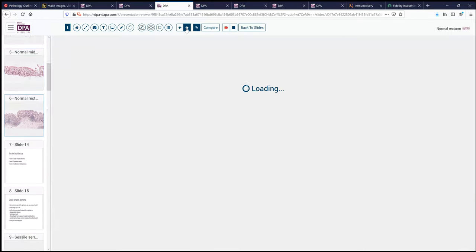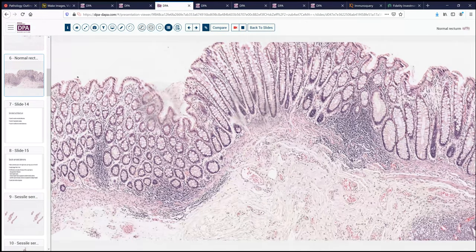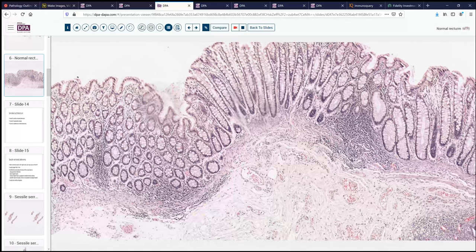Moving into the rectum, we will more frequently see some evidence of lymphoid aggregates. And occasionally we'll see some shortening of these glands — as you see here, there are a few that don't quite reach the muscularis mucosa. That's more frequent as we find more tissue in the rectum. These crypts are fairly closely spaced, and oftentimes in the rectum they can become more widely spaced as well.